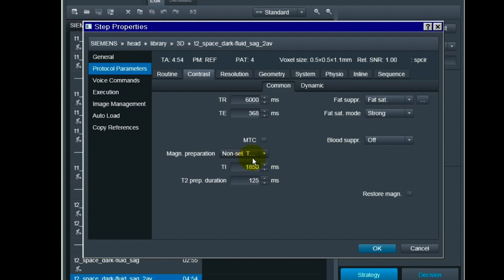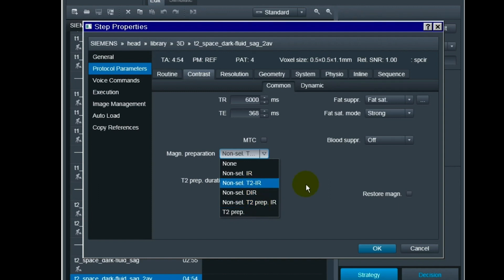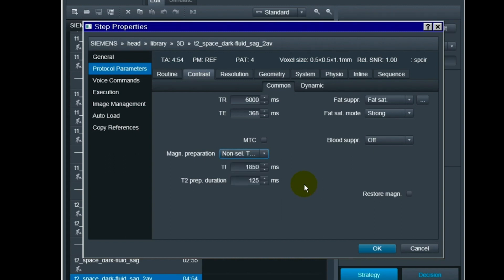The second thing is that there's another pulse right here: non-selective T2 prep inversion recovery. On the older software this option is not available. It's only non-selective T2 inversion recovery on the older software. So this is the thing that makes a difference when it comes to the pons area, when it comes to the flow artifact around that part. This will help that flow artifact. You see there's a new T2 prep duration there, that's a new thing right there.